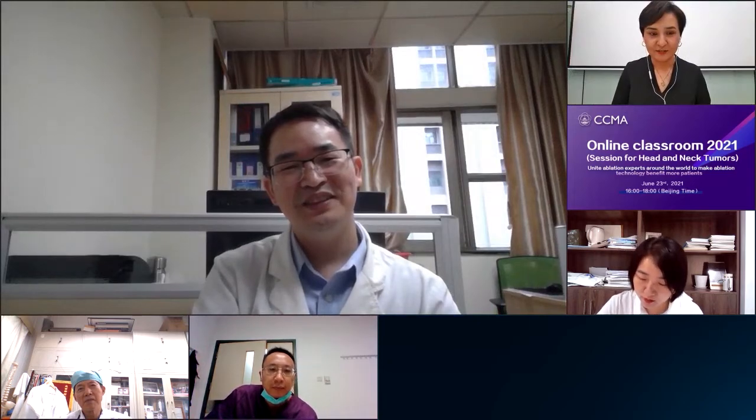Chen about the ablation evaluation. In the case that we do not have the contrast enhanced facility, Dr. Chen suggested to evaluate the ablation results by doing the 怎么样去要达到这种完全消融的效果? Okay, the color Doppler, yes. He suggested to use a color Doppler to evaluate the ablation results. That is from Dr. Chen.